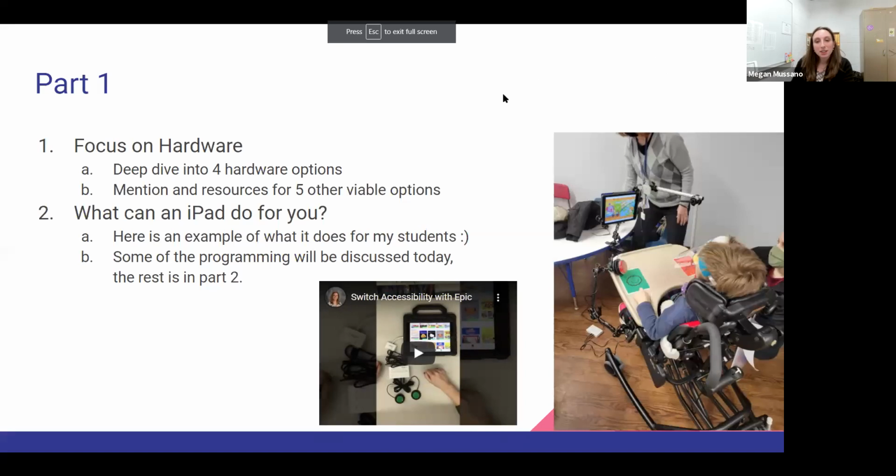So again, the reason I showed that video was to show you that video is all I present to teachers, and that video is what I show to parents, and that's all they need to know to make the iPad work for their students. Now, in order to get all that set up, that's what we're going to talk about from the rest of this session, and part of the next one, is how do we as the professionals help set up the iPads so that it is that easy for parents to just do a little triple click on the home button, or for the teachers to do a little triple click on the home button to make the iPad that accessible.